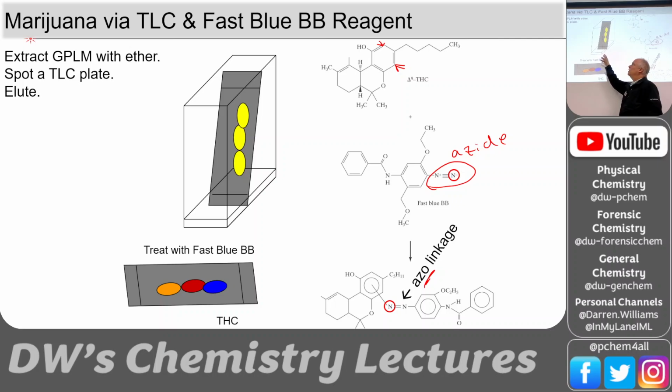So we could extract the green plant-like material. That's what GPLM is, green plant-like material. Okay, with ether, spot a TLC plate and elute, and then you can spray those spots with fast blue, and you'll get THC and all the other components. Maybe you get the 3 main components or a bunch of others.